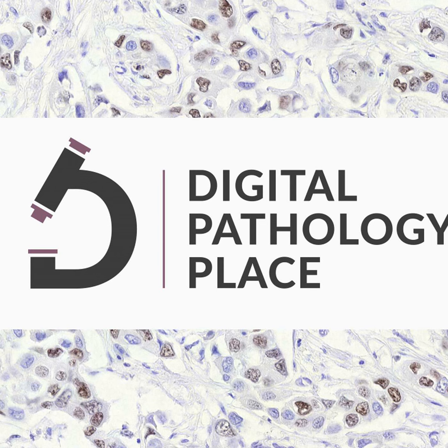So why is that? Is that because it's easier to control a closed system? It's already done in radiology. Why are we doing this from a different angle in pathology? Well, it's a question of proof. The regulators want proof that it's safe to decompose your solution. In radiology, they are now and have long been familiar with the notion that the display software and hardware are completely independent of the scanner software, and that you don't put patients at risk by using a third-party display system.